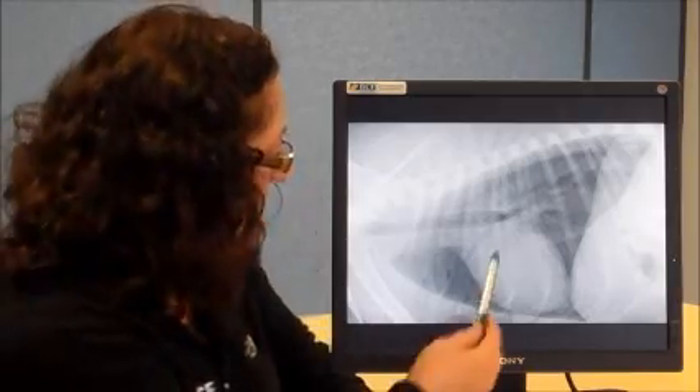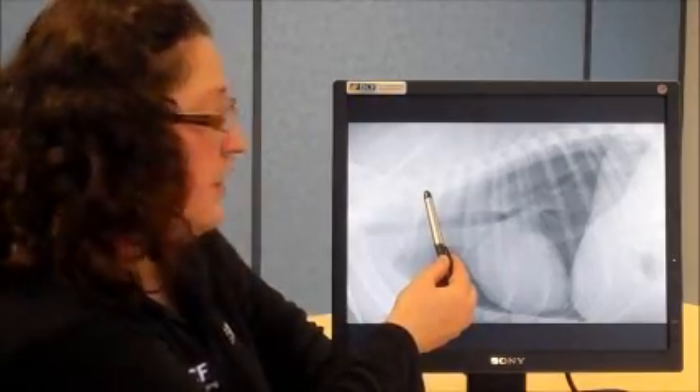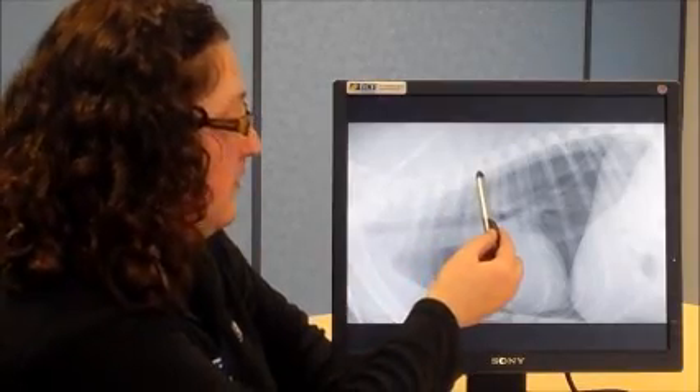The next piece of anatomy you need to identify is the fourth thoracic vertebra. You can identify this vertebra by starting at the first thoracic vertebra — the one which has the first rib initiating from it. If you find the first rib, go up to the vertebra that it is attached to, and count back to the fourth one: one, two, three, four. Then we can start to actually take some measurements.